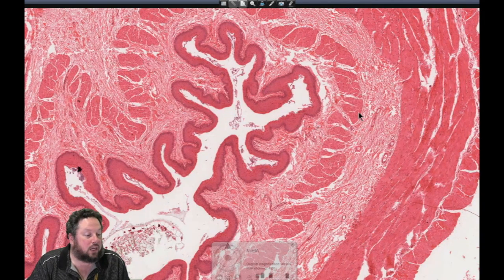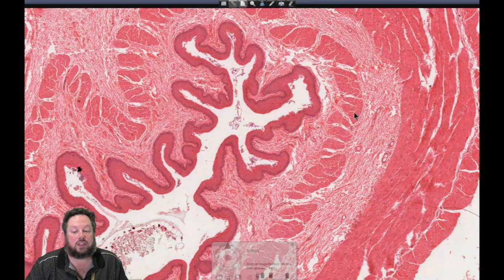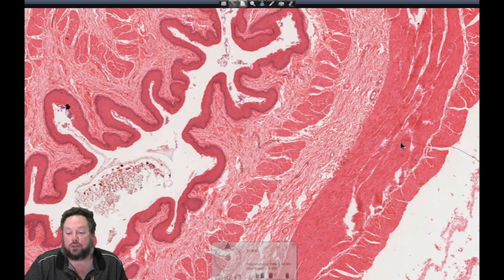Are tunica muscularis and muscularis mucosae the same thing? Really good question. No. So the muscularis mucosae are specifically this smooth muscle layer that's associated with the mucosa. The tunica muscularis is the muscle layer on the outside of the organ, or the muscularis externa is also another name for this layer on the outside here. So the muscularis mucosae is that layer specifically associated with the mucosa. The tunica muscularis or the muscularis externa is this outer layer adjacent to the serosa or adventitia.